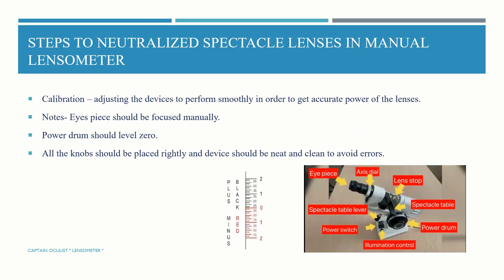Steps to neutralize spectacle lenses in a manual lensometer. First is calibration — we must calibrate first. Calibration is the adjustment of the device to perform smoothly in order to get accurate power of lenses. The eyepiece should be focused manually according to the examiner's refractive error. The power drum should be at zero, all knobs placed rightly, and the device should be neat and clean to avoid errors.